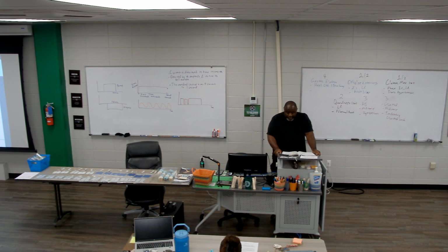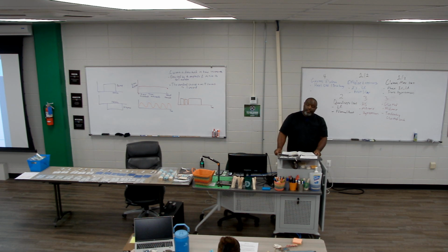Over on the right, it says peak amplitude is measured in current or in milliamps or microamps, or in voltage or volts. So if I'm using something that deals with current, it's going to be milliamps or microamps. If I'm dealing with something that has voltage, it's going to be in volts.